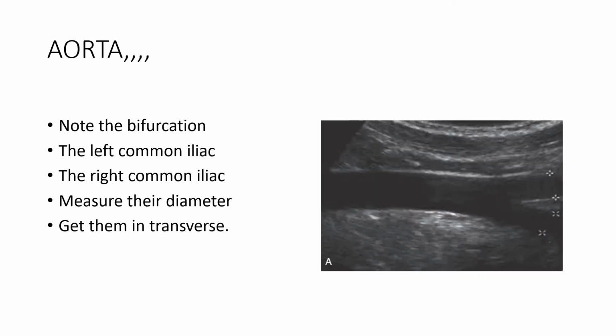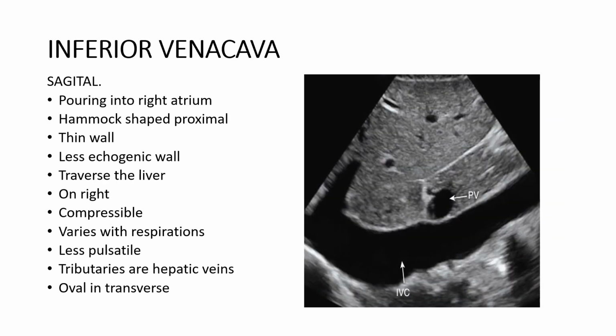With the aorta still, we can see the tubular structure reaching this level, then giving out these two branches. This is the aorta bifurcating into the left and right common iliac arteries. Before bifurcating, the measurement is taken at this level, which shouldn't exceed 2.0 centimeters.